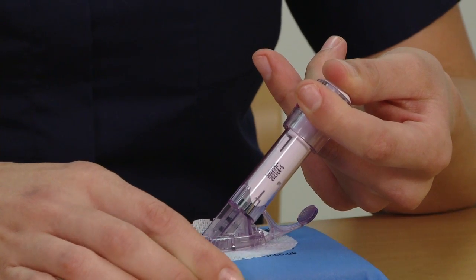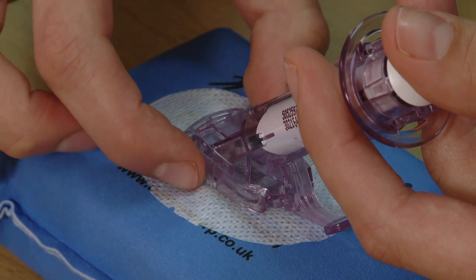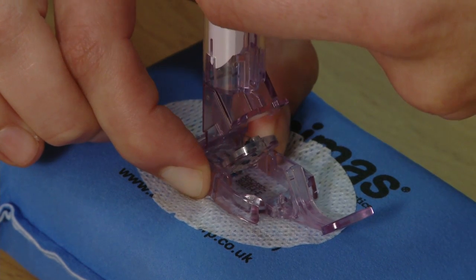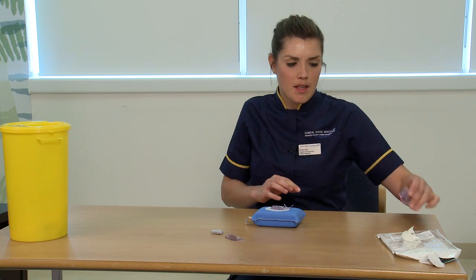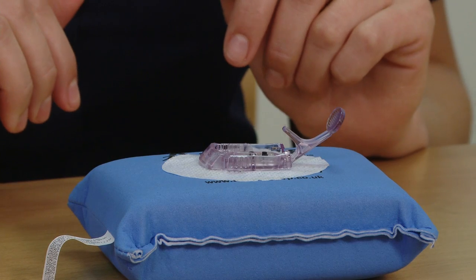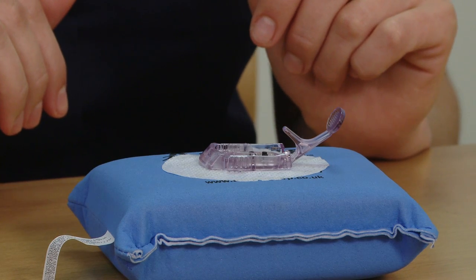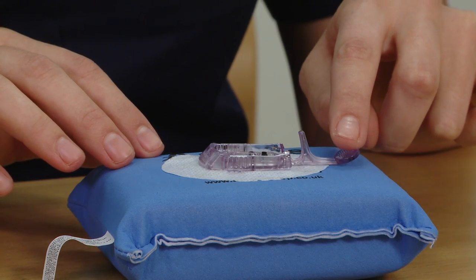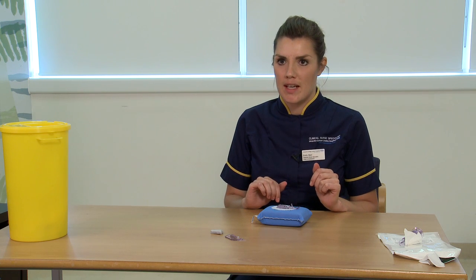What we need to do now is remove the applicator. Squeeze these ridged areas together, rock the sensor applicator forward, and then place it to one side. You need to make sure that the transmitter latch is flush against the skin, so just push that down gently. Now we're ready to attach our transmitter.